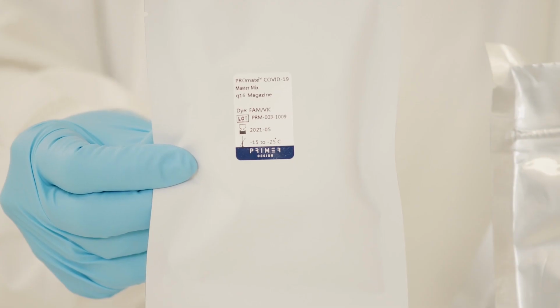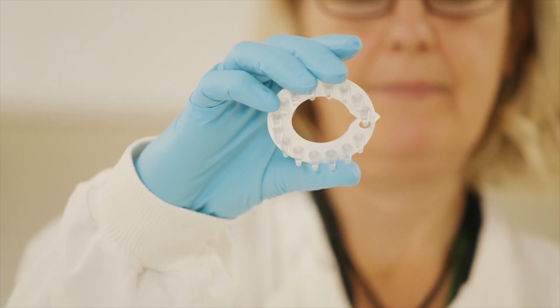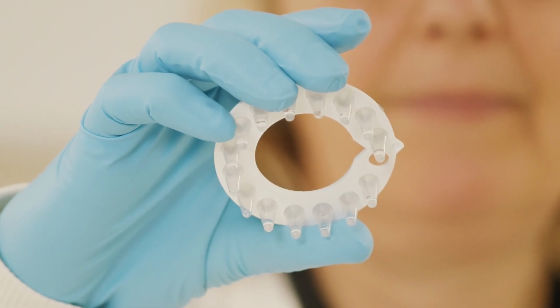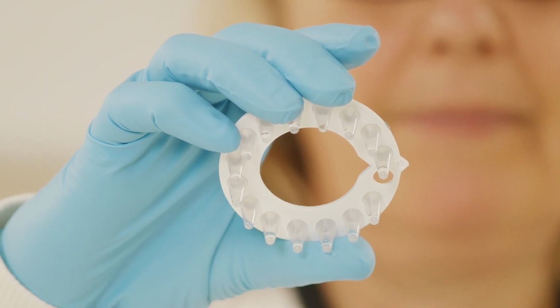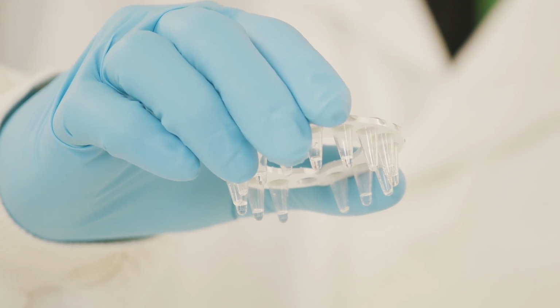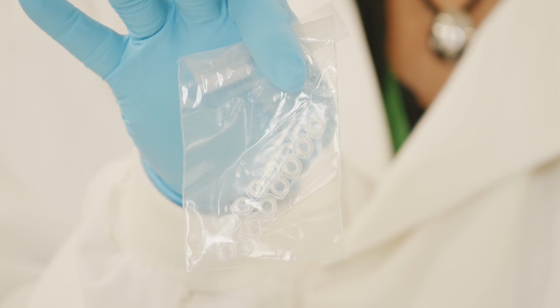The MasterMix magazine foil pouch contains one magazine, preloaded with qPCR reaction tubes containing MasterMix. The liquid within contains the primers and probes for both the COVID-19 target and the internal control. As well as these, it contains the MasterMix plus the internal control template. It also contains qPCR tube lids for sealing.